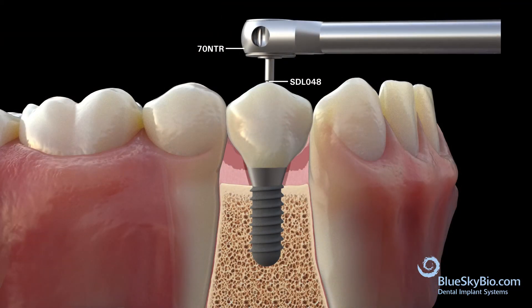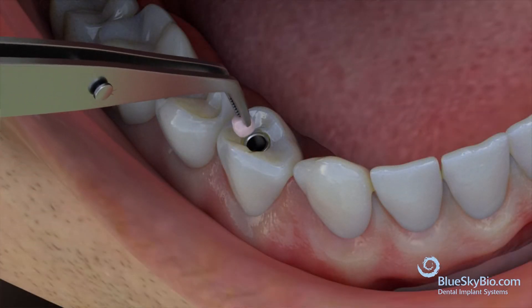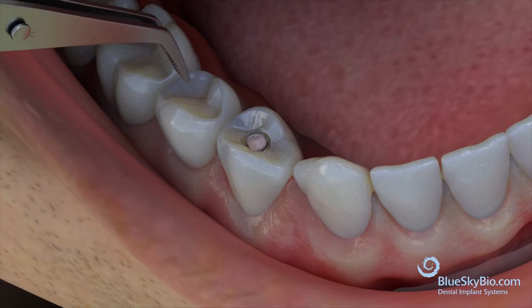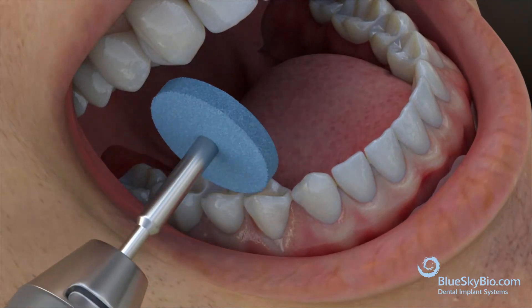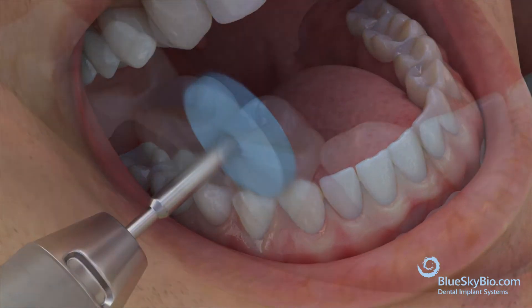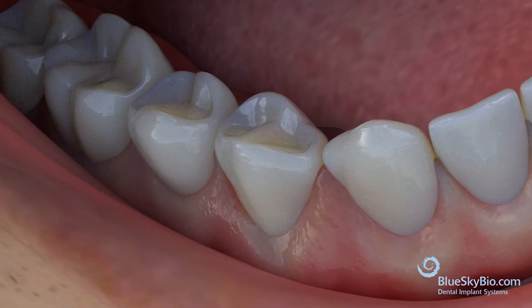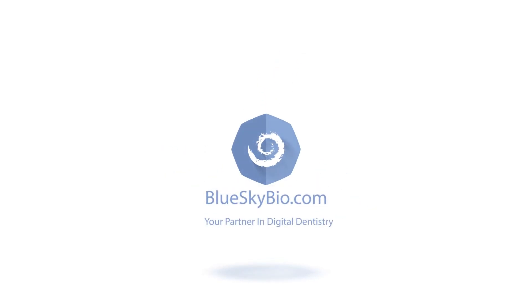Torque the screw at 30 Ncm. Place a small amount of wax in the channel to protect the screw head, then add composite to the screw access hole. Polish the restoration.